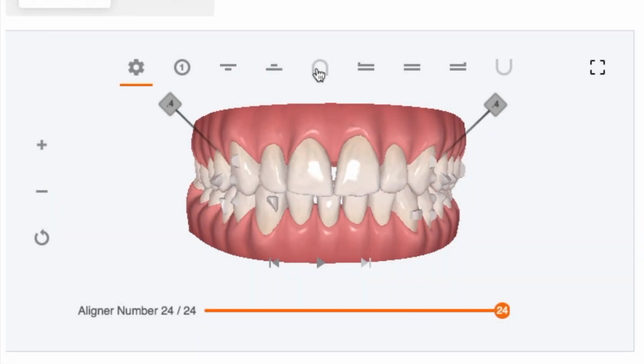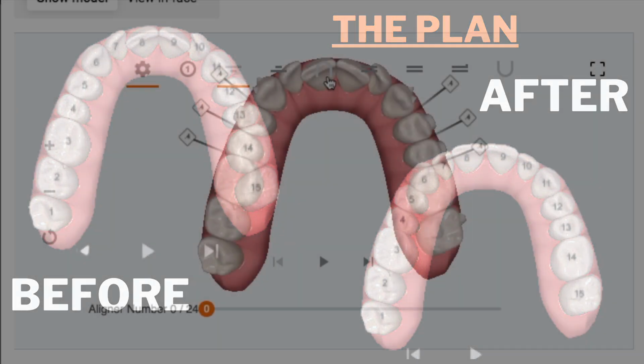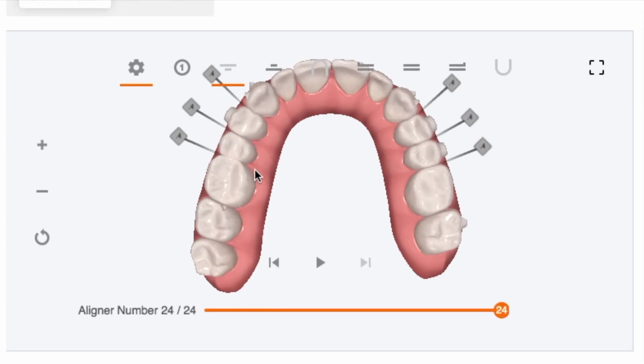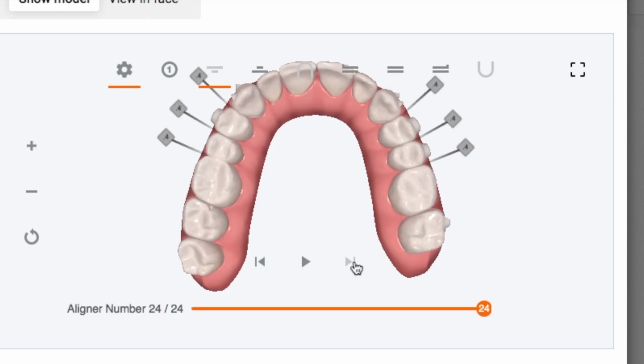So here is the palate view. These are my upper teeth as if you were looking up at them. So here the thing to notice is that before treatment, my palate is a little closer to being a V shape. And then after treatment, it's a more rounded U. That widening of the palate is what gives the teeth room to move. And this widening of the palate is most of the work that's been going on with my aligners so far.